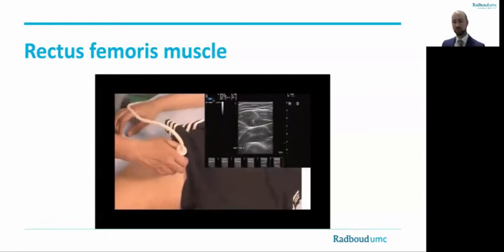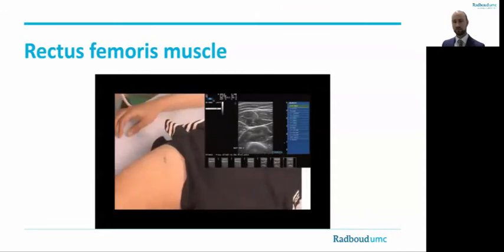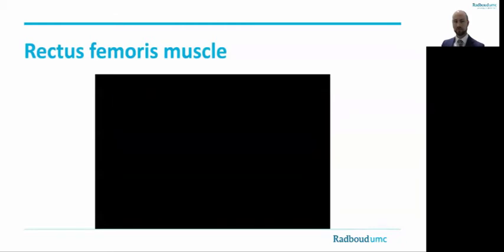The third image is also used for the muscle thickness measurement using the electronic diameter calipers on your ultrasound device. After placing the calipers, the image is stored again. You have now captured the ultrasound image of the rectus femoris muscle for offline visual grading and quantitative grayscale assessment.